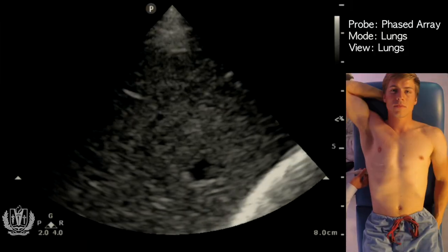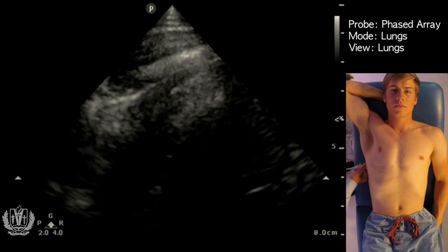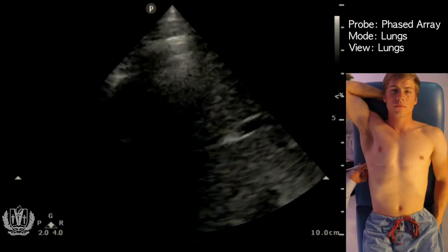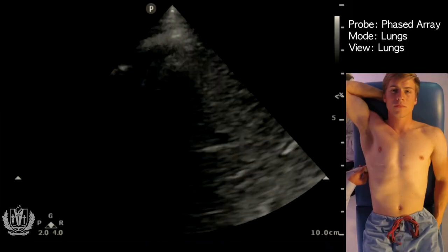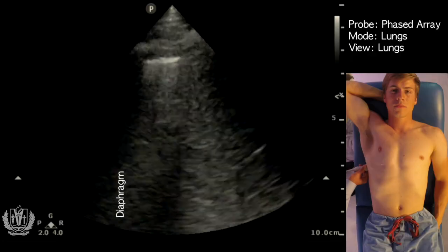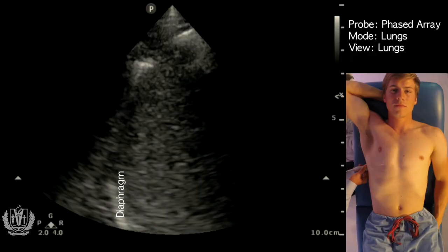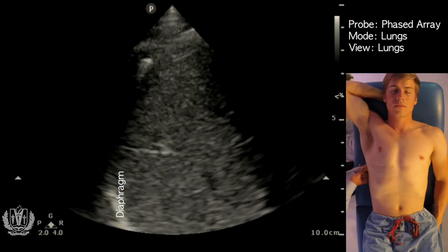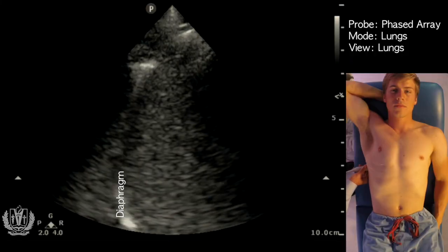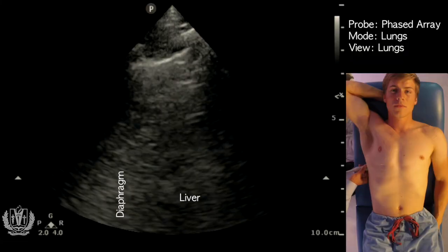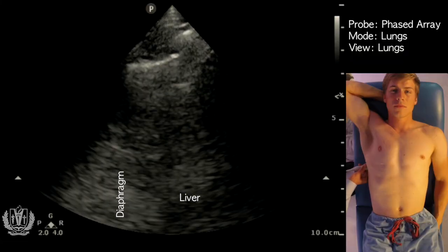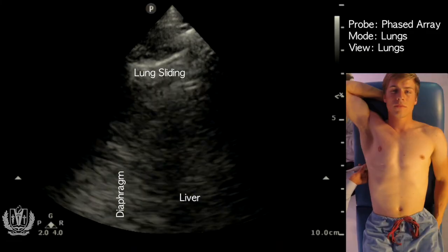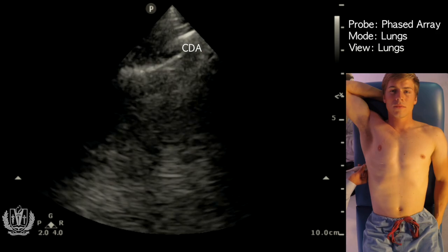Going more inferior, you can actually see the liver. Once you see the liver, go just above the diaphragm. You can see the diaphragm here. This view in the mid and posterior area where the diaphragm is, is where you would most likely see a pleural effusion — it's very sensitive for that. You can see the diaphragm and the liver moving superiorly and inferiorly as he breathes in and out, as well as lung sliding. This is your costal diaphragmatic angle.